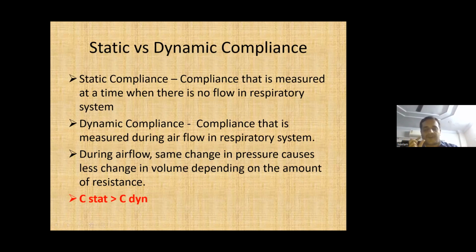Okay, so that is why in real life scenario, the static compliance is always greater than the dynamic compliance. And the compliance that we measure on the ventilator, which the bedside ventilator measures and gives us, that is the dynamic compliance. That is always less than the actual lung compliance, the static lung compliance.